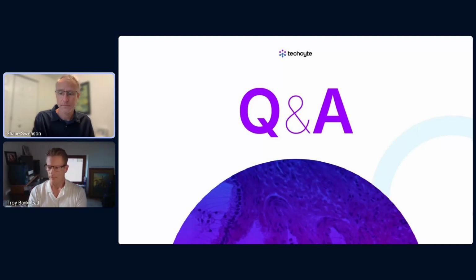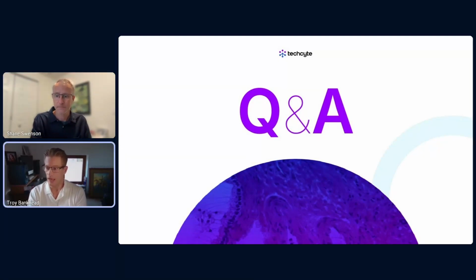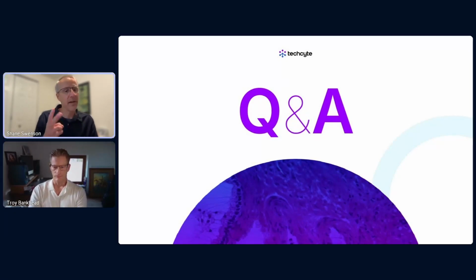Thanks for that. Yogesh has asked, what are your thoughts on a hybrid model? Hot on-site, and I assume we're talking about storage and treatment. Hot on-site, cold and archival on the cloud. It's interesting. We actually see both hybrid models. So the advantage of hot on-site would be local access, and so you would expect great performance. And then the cloud as a trusted partner for a long-term archive with high data resilience because of the backup solution that they provide. And we've seen some looking at that model.